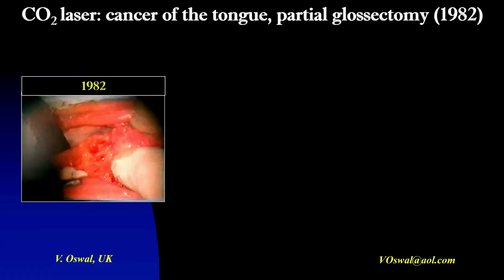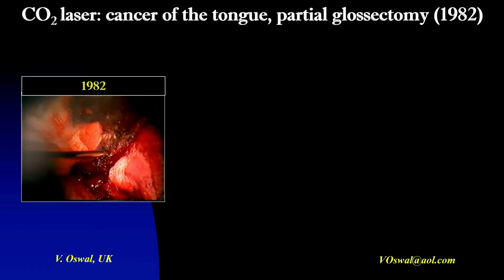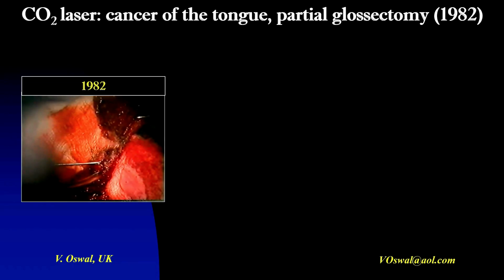Having seen the remarkable results of the CO2 laser surgery on the tongue, I was now ready to tackle cancer of the tongue. This 1982 CO2 laser partial glossectomy for tongue cancer demonstrated significant advantages over traditional methods. It resulted in minimal blood loss, with only a few larger vessels requiring ligation.